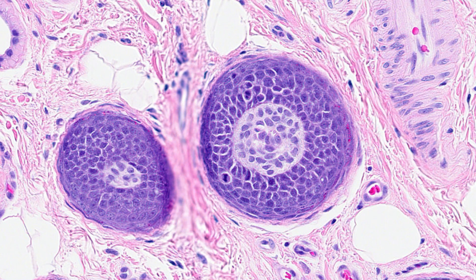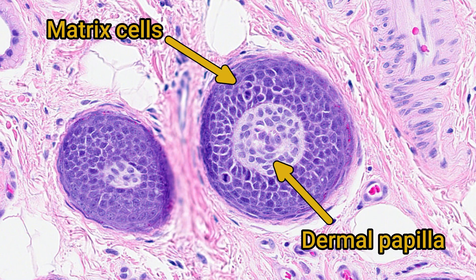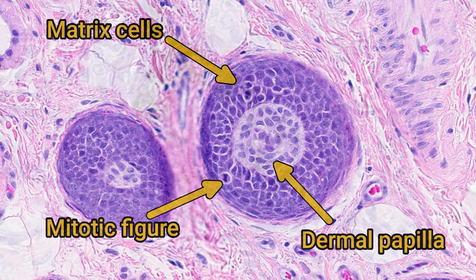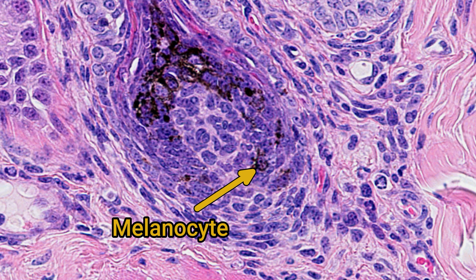The basophilic epidermal cells surrounding the dermal papilla are matrix cells — germ cells that will produce both the follicular epidermis and the hair shaft, so it's common to see mitotic figures in this population. You might also see melanocytes in and around the hair bulb producing pigments that will colour the hair shaft.